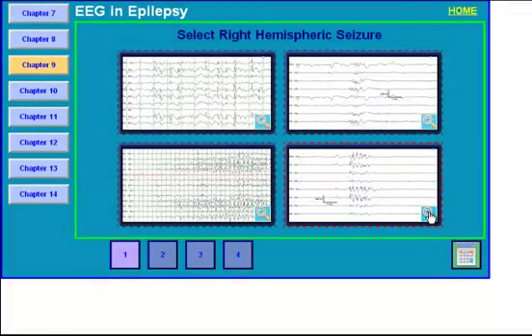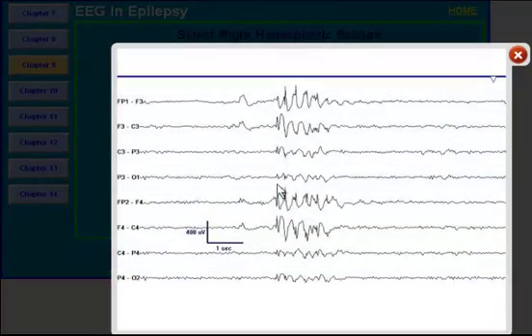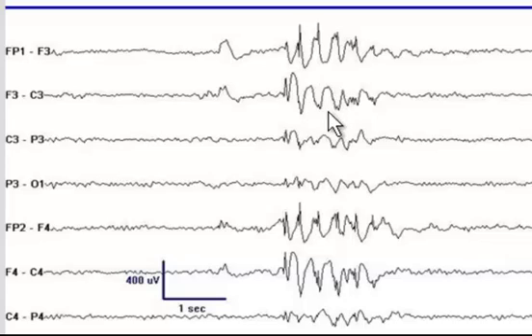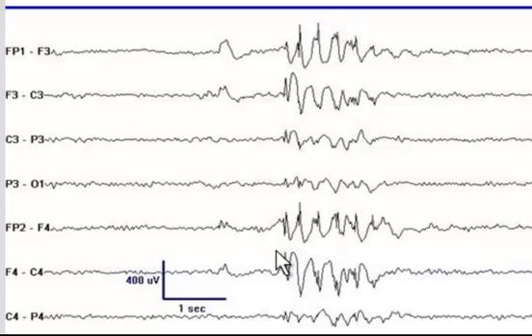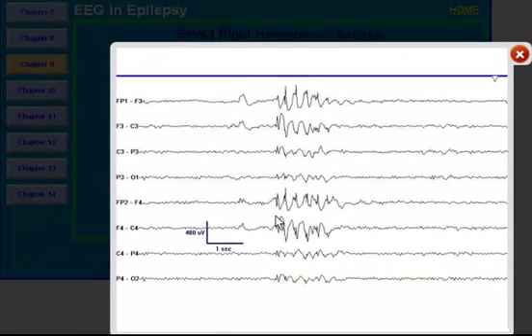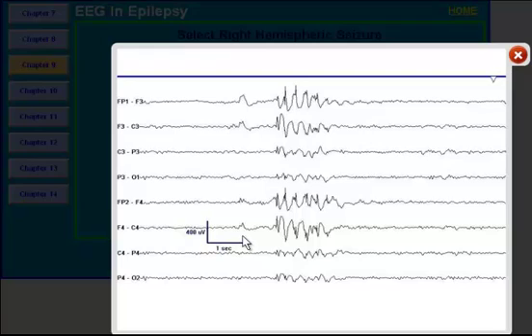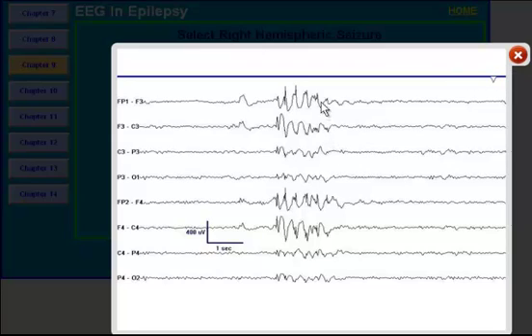And what about this one? You see sharp waves that are maximal in the frontal head region, sort of a spike and wave discharge. But you do not see an evolution in frequency. If this had persisted over 10 seconds with changes in amplitude and frequency this would have constituted an electrographic seizure. In children with absence seizures it is the duration of spike and wave that speaks whether this person has an electrographic seizure or not. This is epileptiform discharge meaning this person is at high risk for seizures.